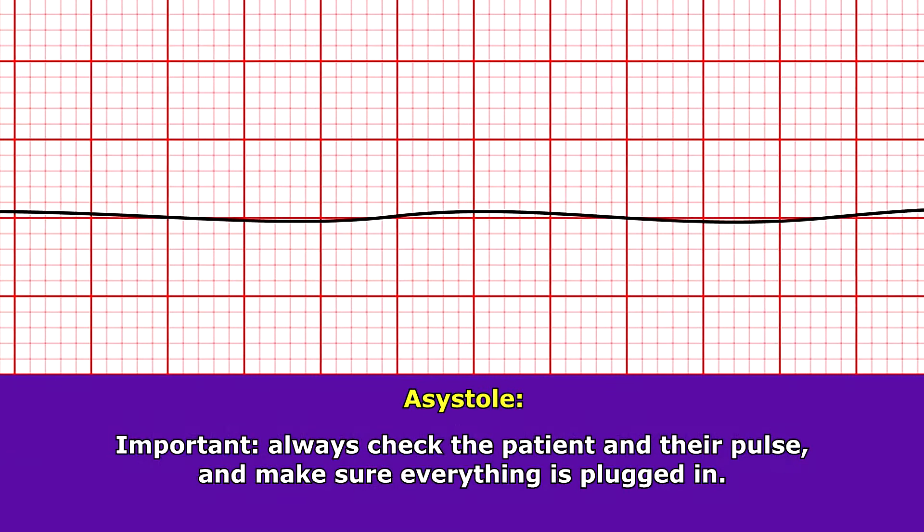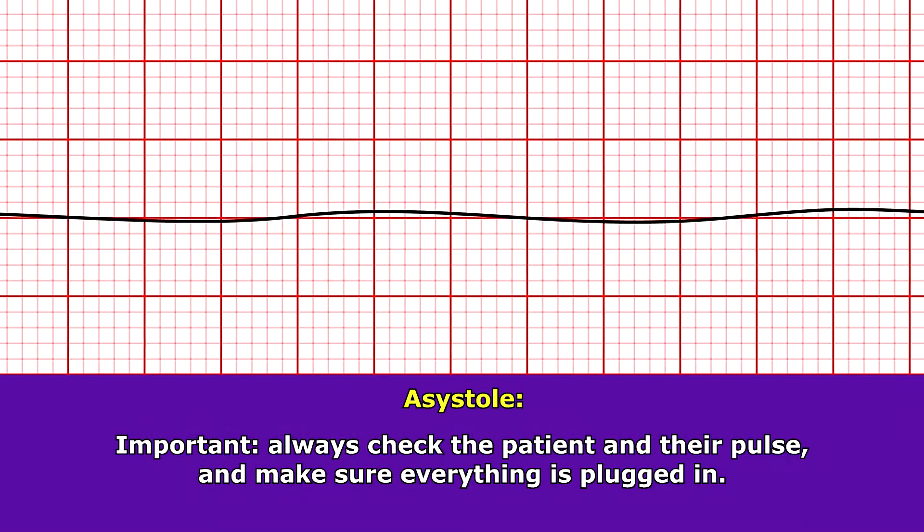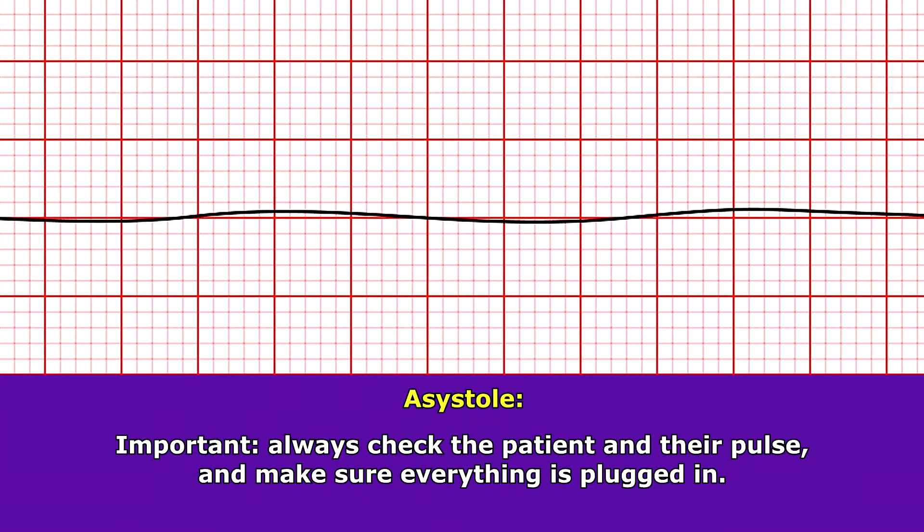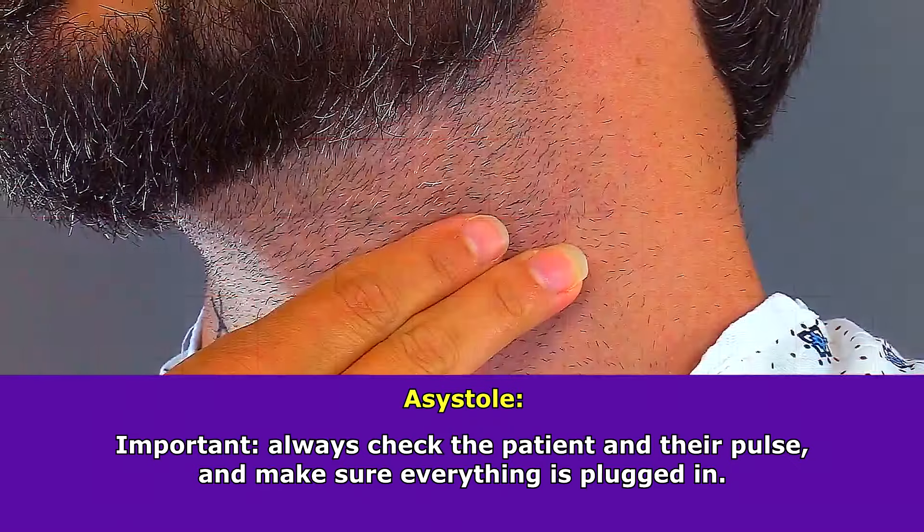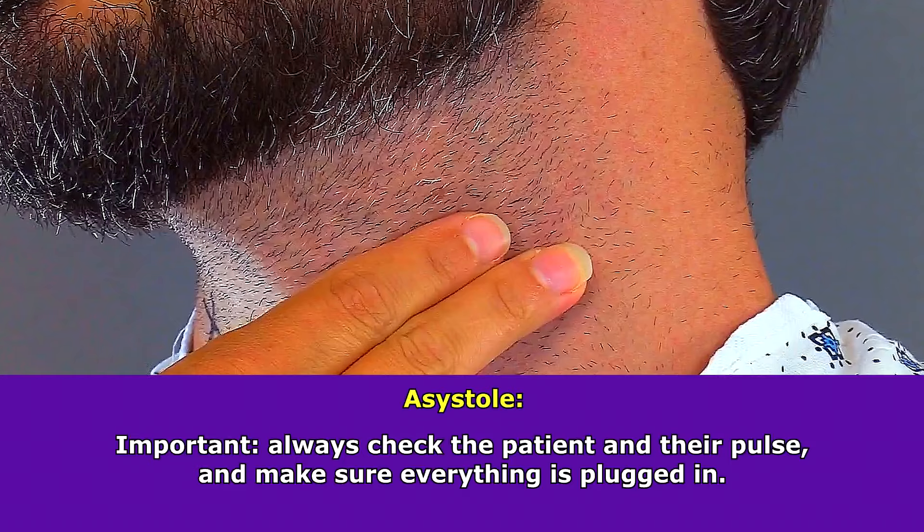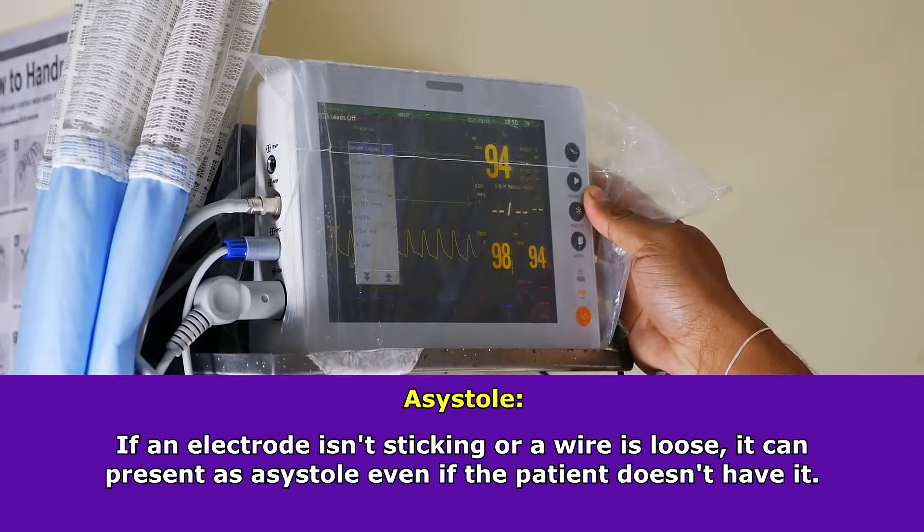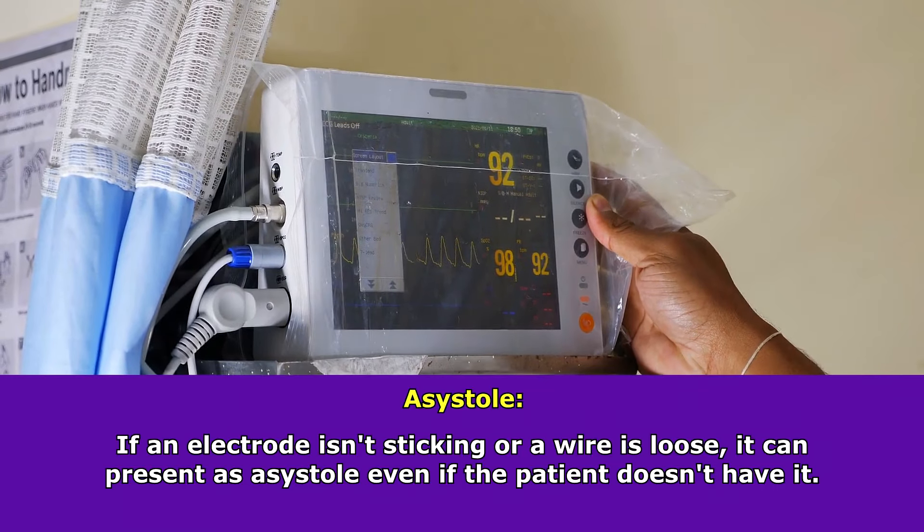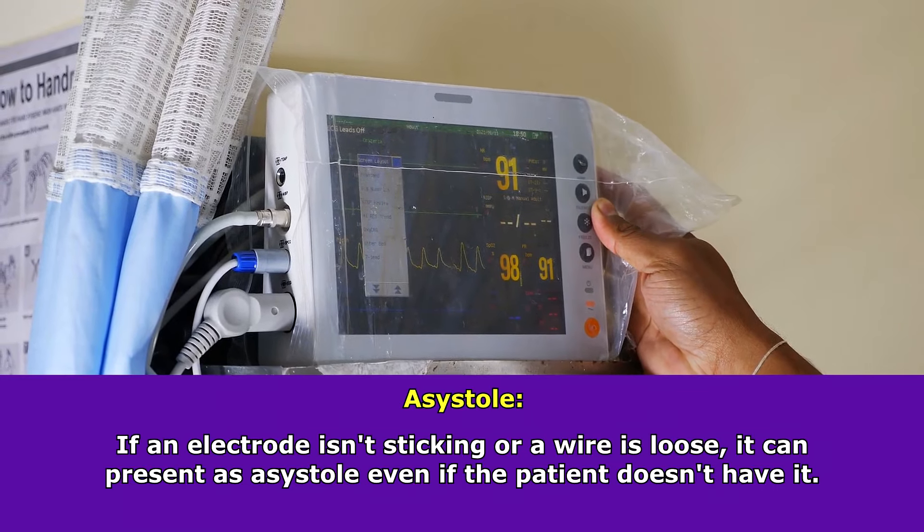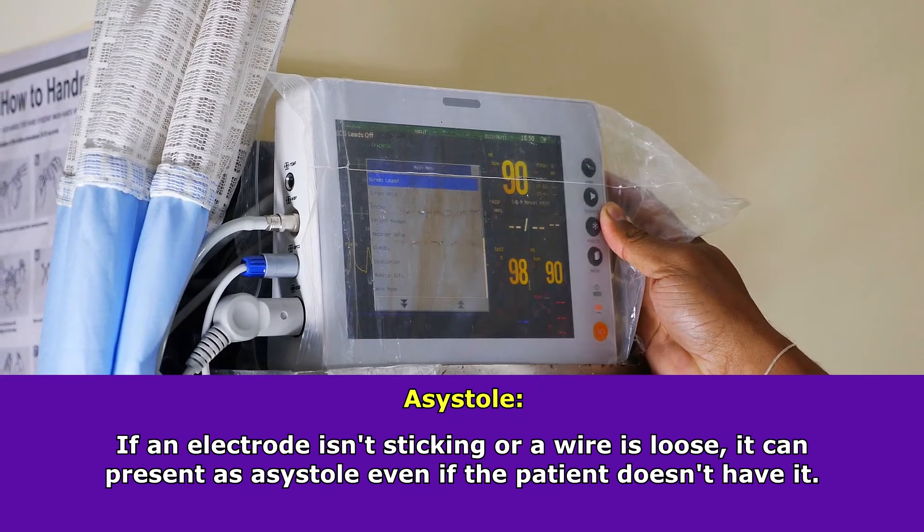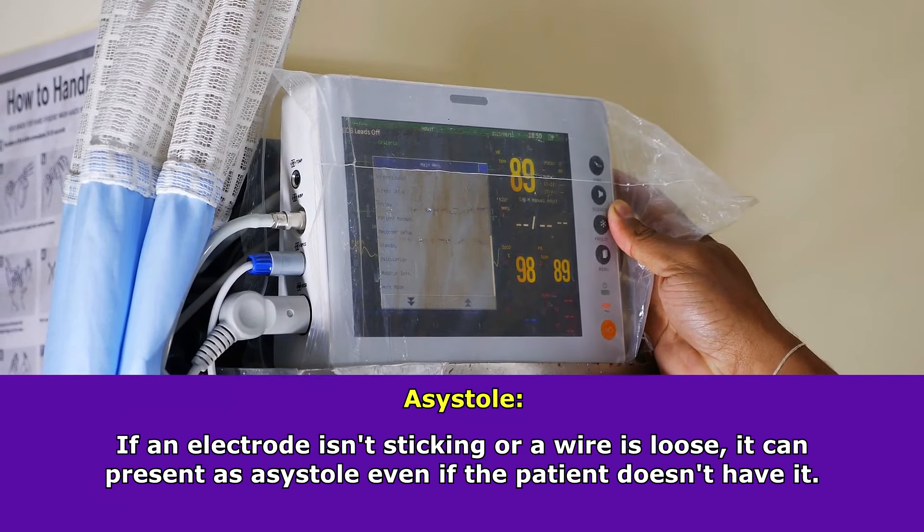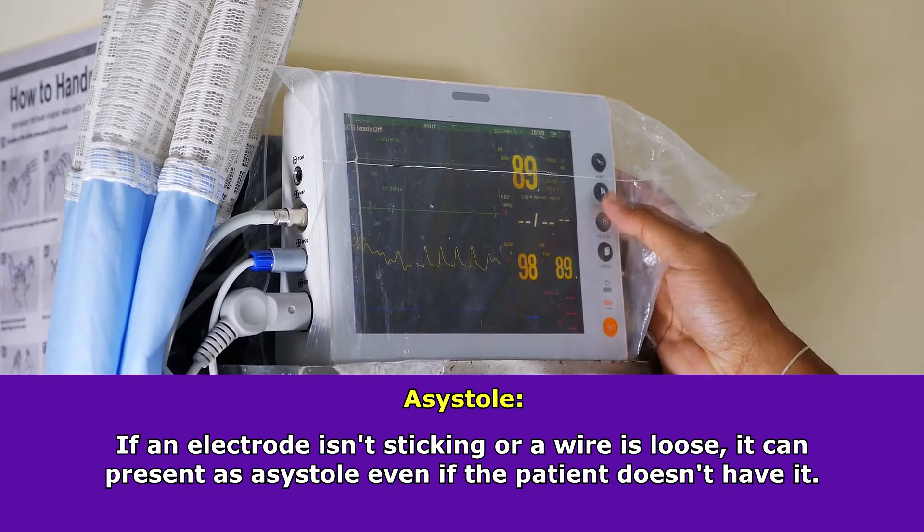Whenever you see a flat line on an ECG, you want to immediately check your patient. Always check them, check their pulse, and make sure everything is plugged in and attached. Because if those telemetry wires become unplugged or an electrode isn't sticking right, or you have a bad connection, it can present as asystole and you don't truly have it. Always check your patient.